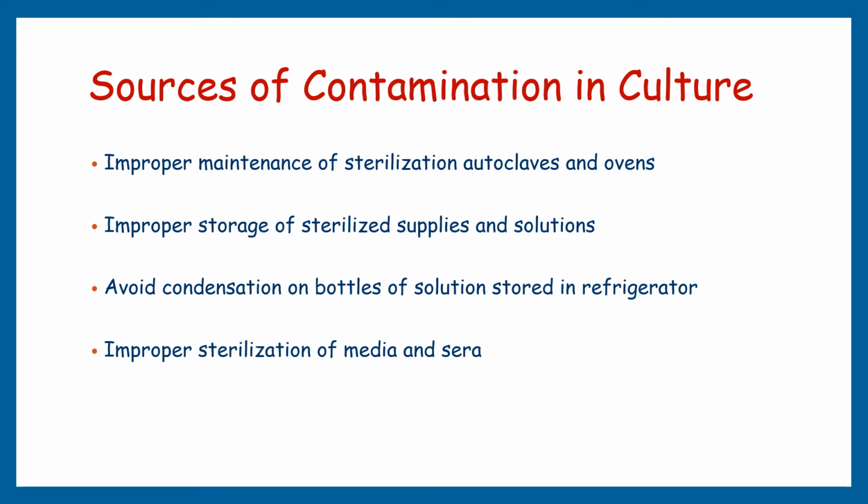Media, sera or other animal-derived biologicals are not heat sterilizable, so they require membrane filtration, or sometimes radiation, to remove biological contaminants. Membrane filtration through 0.2 micron is very effective in removing most biological contaminants.